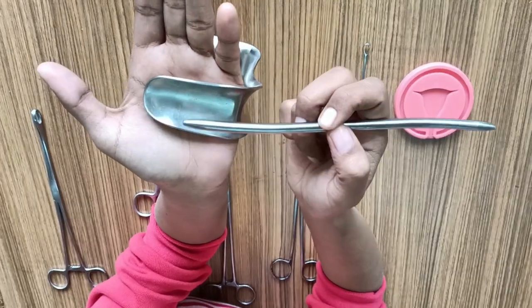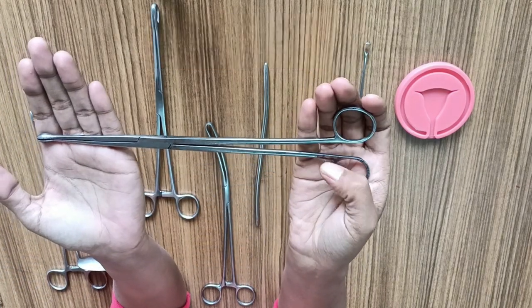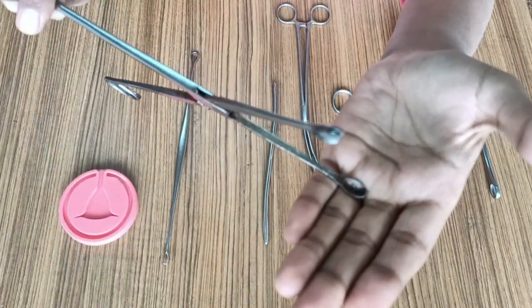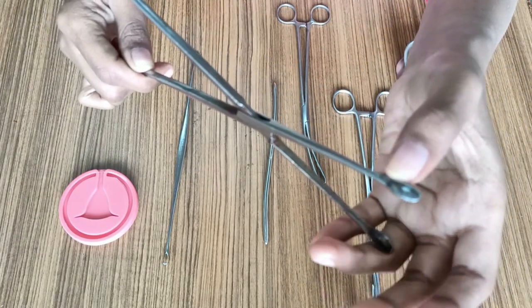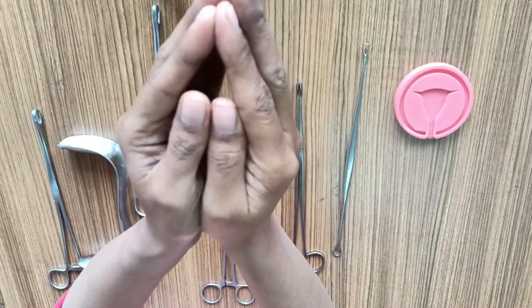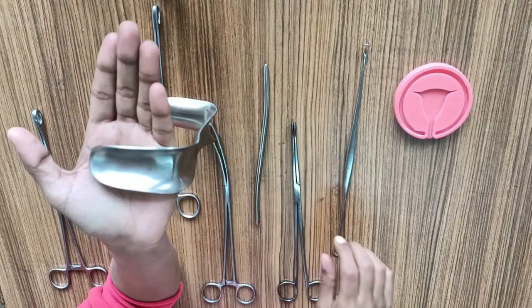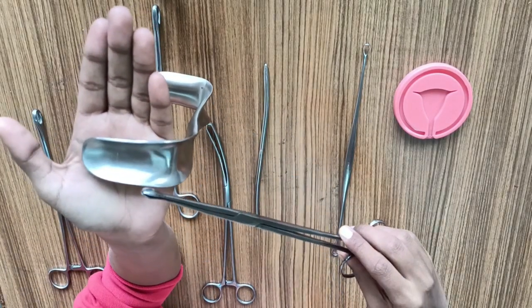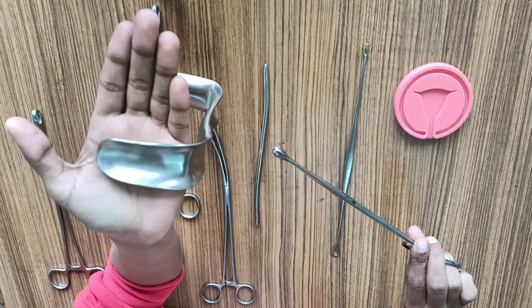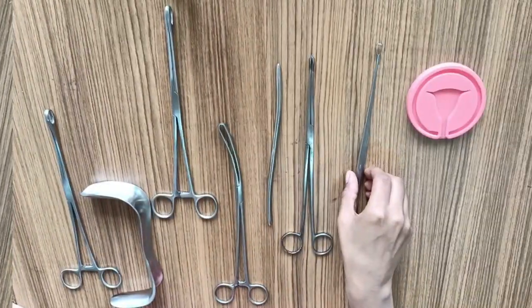Gradually dilate the cervix moving from smaller to bigger size dilators. If you are performing an obstetric evacuation, the ovum forceps is required. It does not have a lock and its forepart is cup-shaped with fenestration. The basic mechanism is that it captures the products of conception and removes them — you go in with the instrument closed through the vagina and cervix into the uterine cavity, then open and close and bring it out. The products of conception inside the cup can then be sent for histopathology.